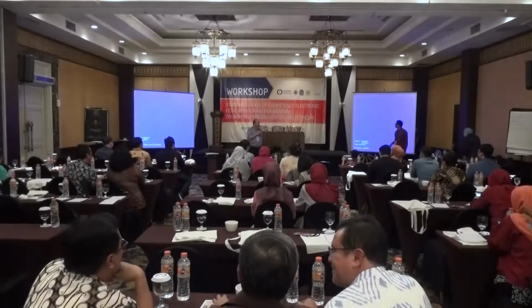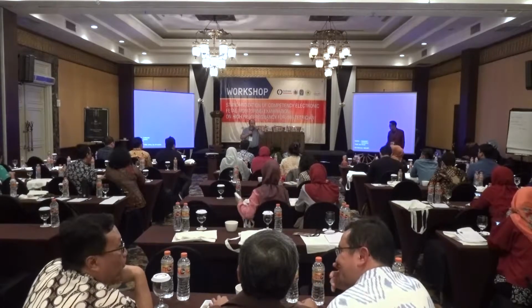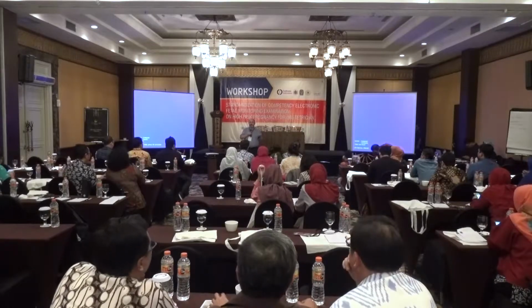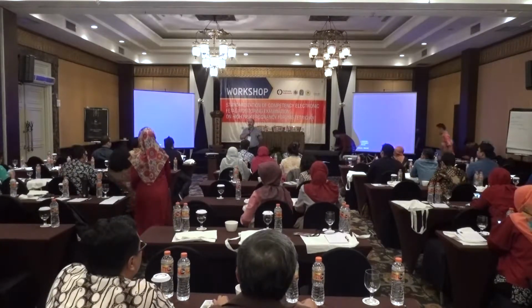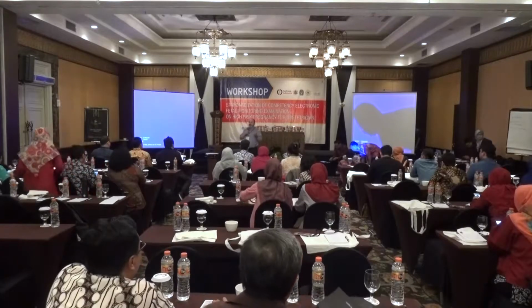Lovely lunch. So we stopped earlier on, before lunch, where I was talking about the different types of decelerations. So there are 4 types, as I mentioned. Can people hear me at the back? Can you hear me okay? Yeah. So there are 4 types of decelerations: earlies, lates, variables, and prolonged.